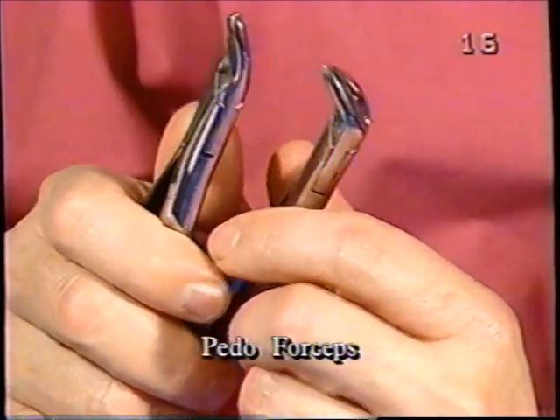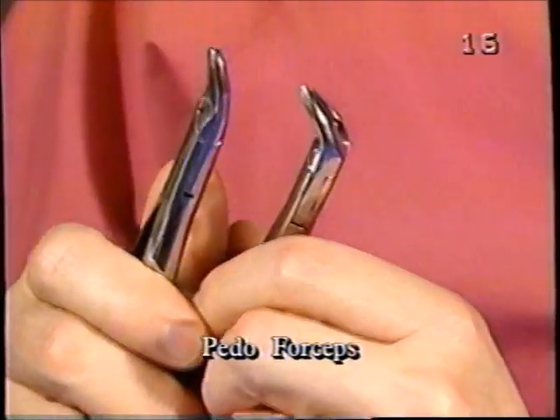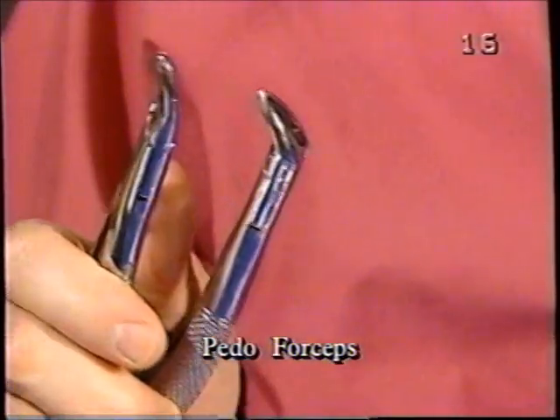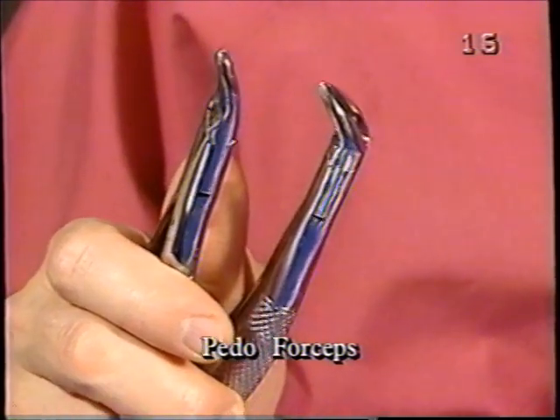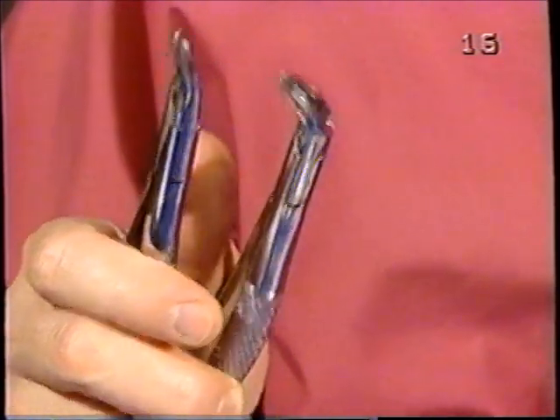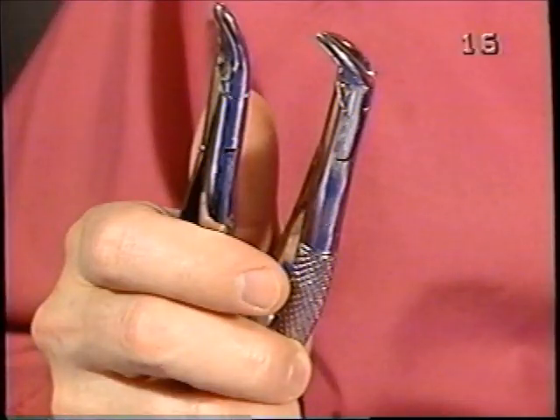And those are pedo forceps, and I use these many times with adult teeth on adult patients, particularly for single roots or for lower anteriors, for example. Better control with these smaller instruments.